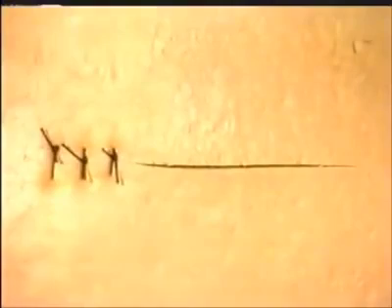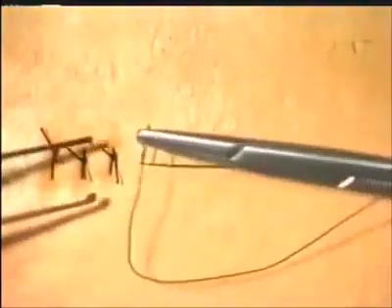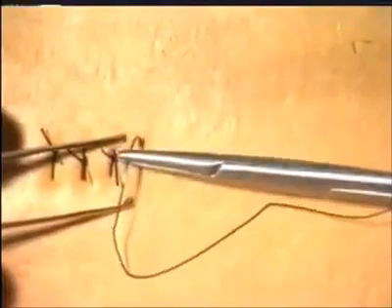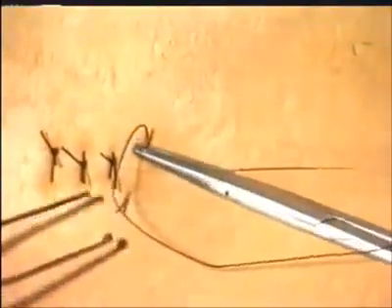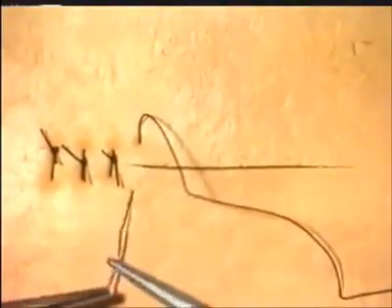Once again, tie a reef knot. When inserting sutures, adopt a one-two-three technique. One. Two. Three.